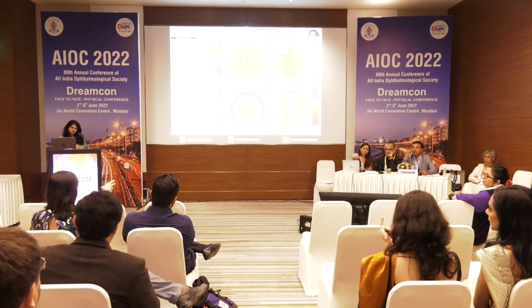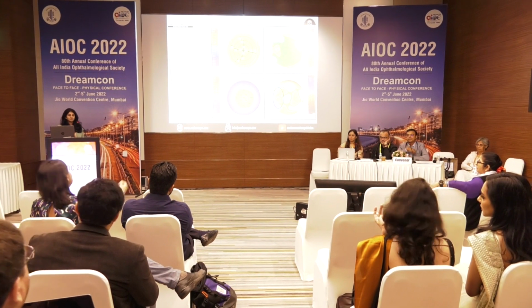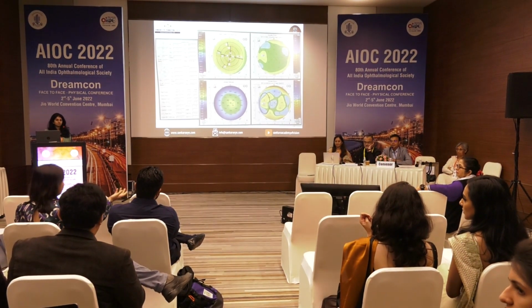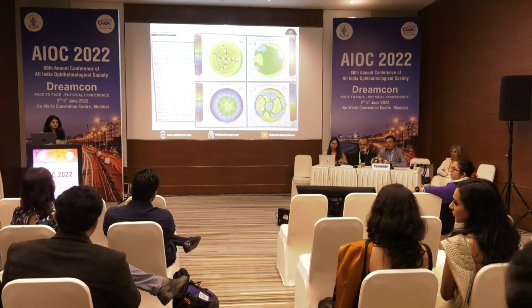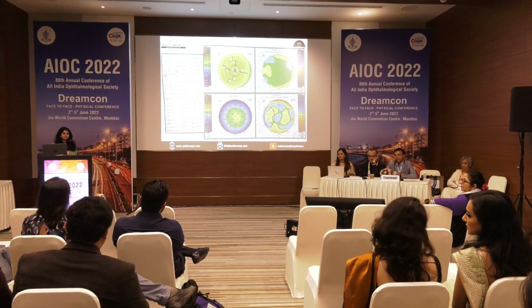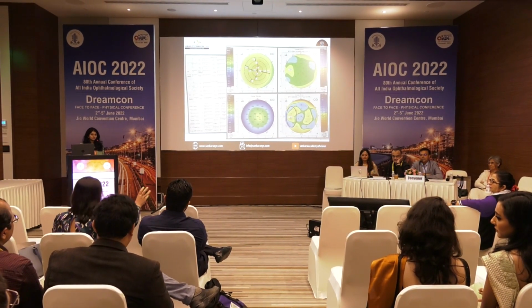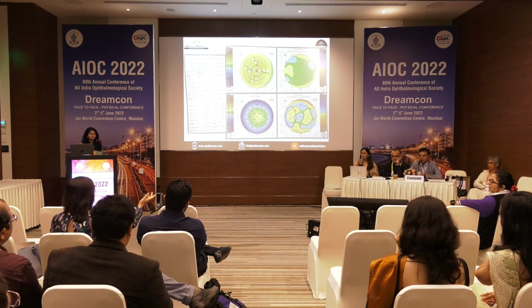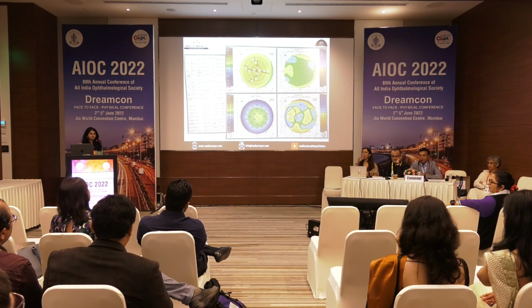No, it's on the temporal side. It's in the periphery. There's no corresponding thinning also. It's not in the central zone, and if it's bilaterally symmetrical, I don't think we need to worry about it too much. If it was in the center, the posterior elevation is more in the central 4 to 5 millimeter zone, that's where you'd expect, or there was another red flag corresponding to the thinness of the cornea, then I would be more wary of that.